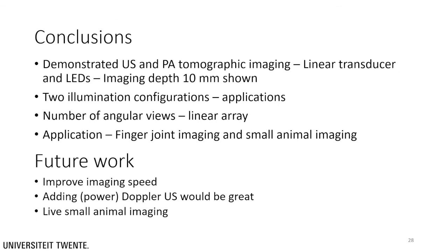It is time to come to a conclusion. We demonstrated combined ultrasound and photoacoustic imaging using a standard linear ultrasound transducer and LEDs for illumination, and we have observed an imaging depth down to 10 millimeters. The ultrasound transducer and the LEDs can be combined in a compact and affordable ultrasound and photoacoustic scanner, such as shown here with the AcousticX.